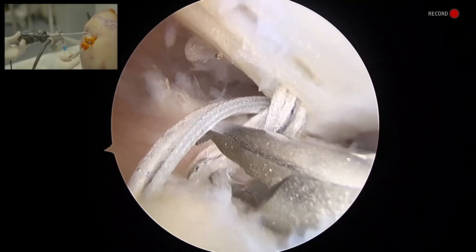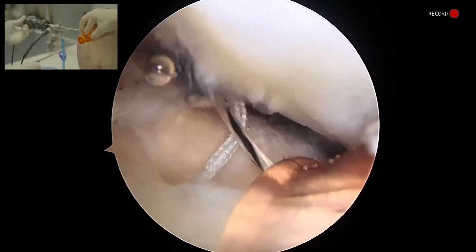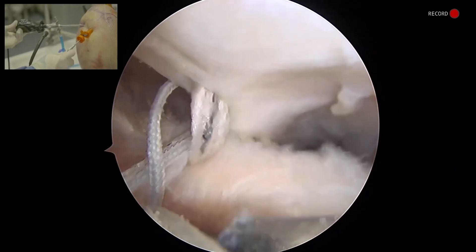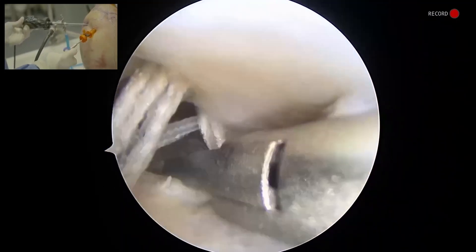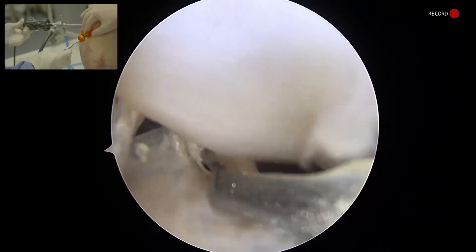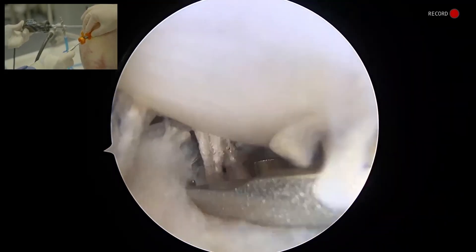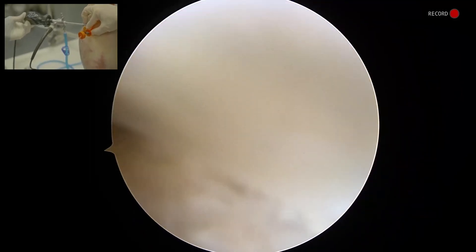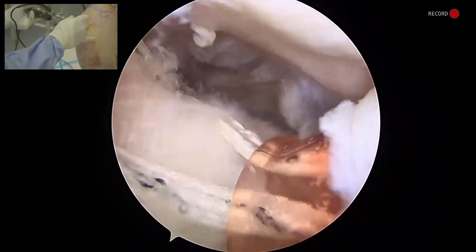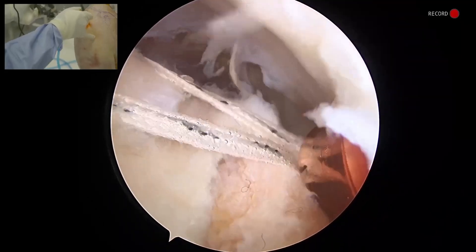I'm going to take a tape from the anterior pass of each of my anchors — the anterior pass of my posterior anchor and then the anterior pass of my anterior anchor here. I'm grabbing the tape to bring out for my lateral row. Now I've got these two tapes that I'm going to bring out for a lateral row anchor.